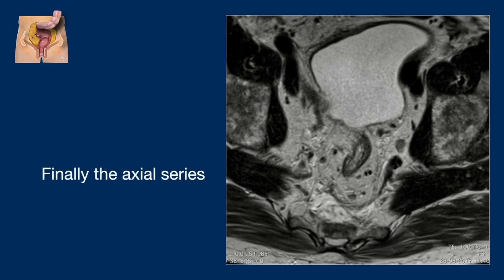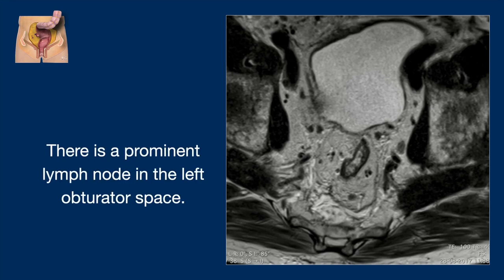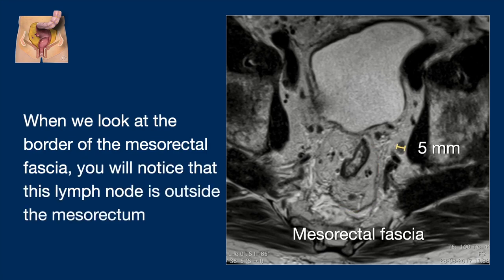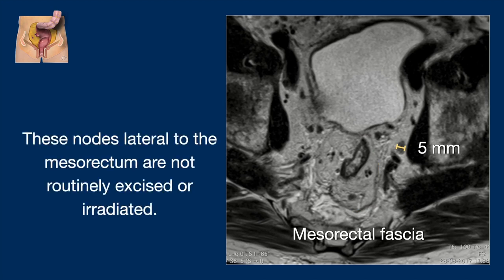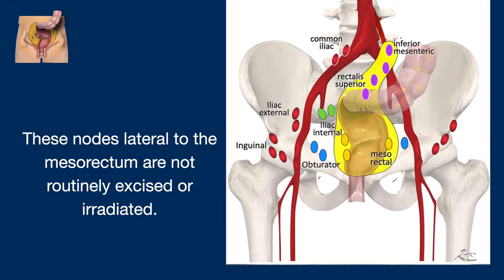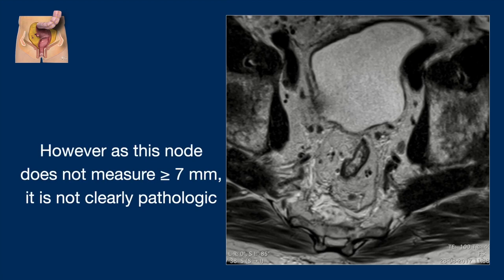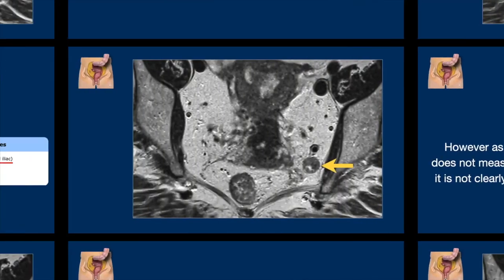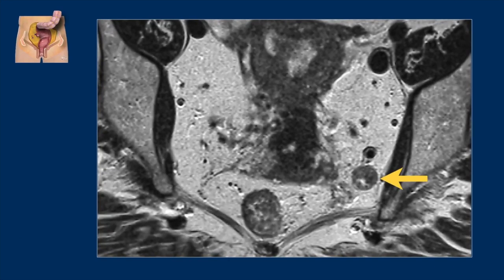In the axial series, notice a prominent lymph node on the left side. Looking at the border of the mesorectal fascia, this lymph node is outside the mesorectum, with a short axis of about 5 mm. Nodes lateral to the mesorectum are not routinely excised or irradiated. The criteria for these lateral lymph nodes differ — only size matters, and they need to be 7 mm or more. As this node does not measure more than 7 mm, it is not clearly pathologic. In contrast, in another case there clearly is a pathological lymph node just lateral to the mesorectal fascia in the left obturator space, which must be mentioned in the report.